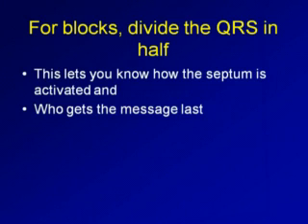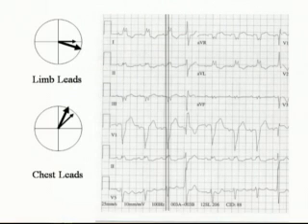So you're looking at the EKG, you're finished looking at the P wave and the intervals, and you find that your QRS duration is long. If you go to V1, that's going to tell you who got blocked. Because the right ventricle, when it depolarizes, has a vector that points right and anterior, so at your right breast. When the left ventricle depolarizes, it depolarizes back towards your scapula. And remember, the left ventricle usually wins, but when we separate them apart, we can sometimes see them individually.